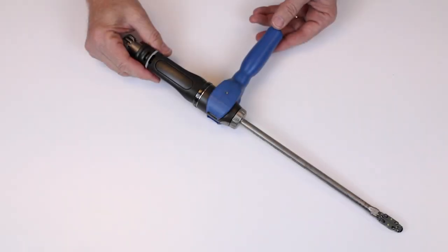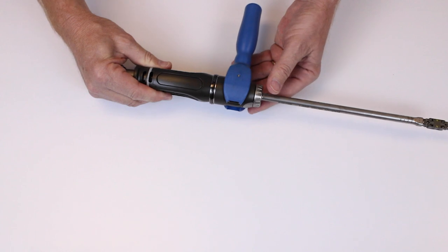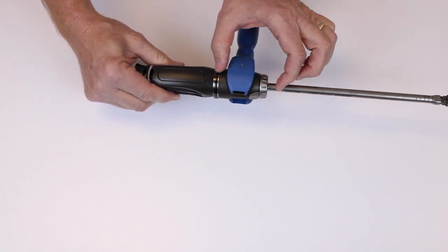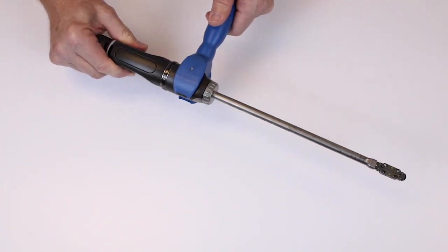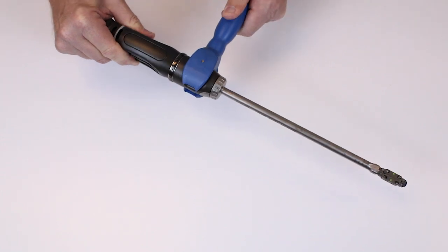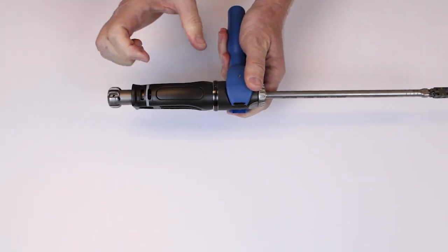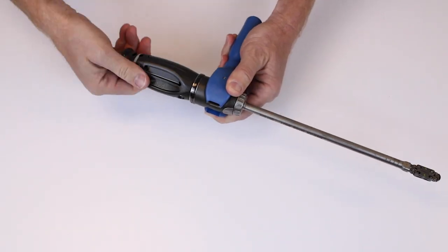It's important to note that there are two sections of the handle. This section controls the rotation of the implant. This section controls the expansion of the implant.